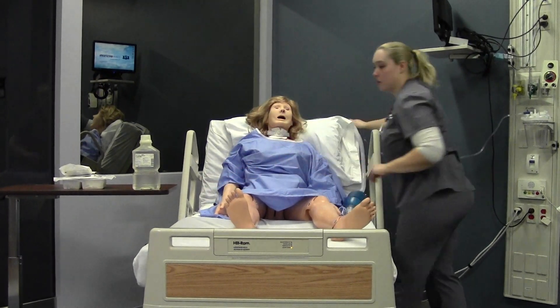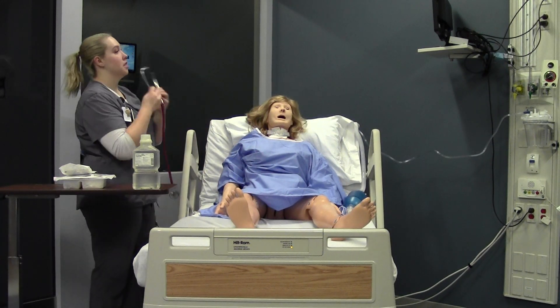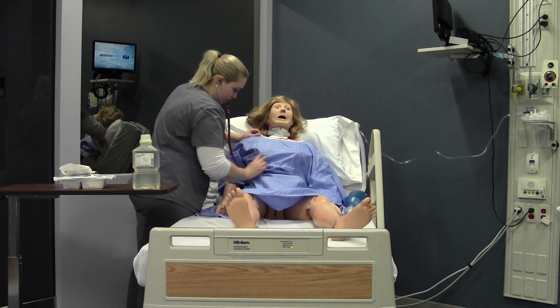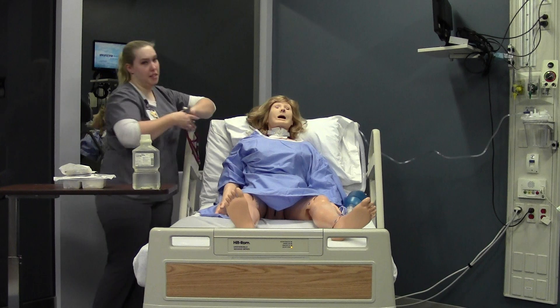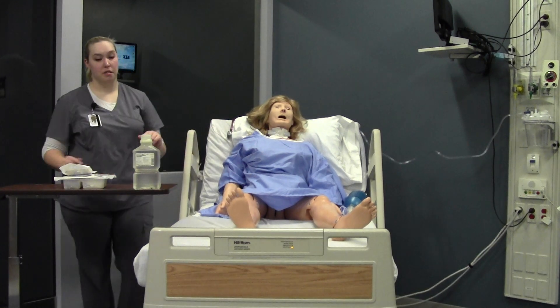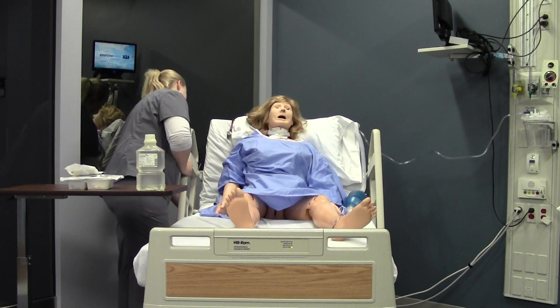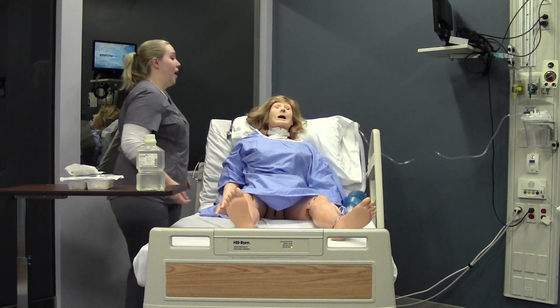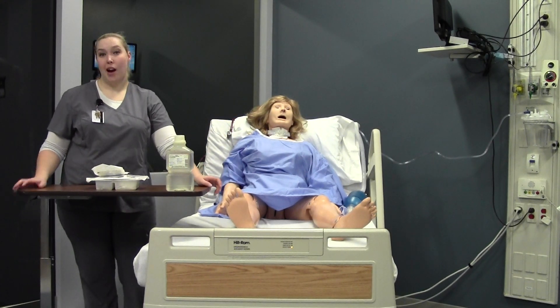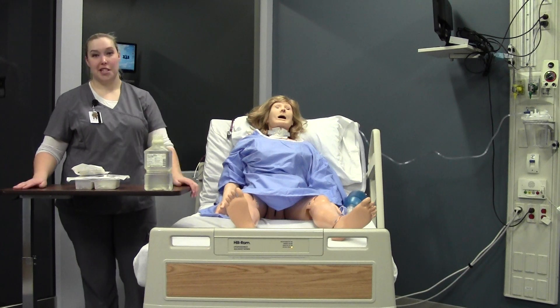Make sure your suction is working. I'm just going to reach around you and get your tubing positioned. You may also want to do a quick respiratory assessment — listen to their front and see how their lungs sound. I don't like to have my stethoscope on me while I perform the skill, so I'll tuck it off to the side. While I do trach suctioning, I have my patient hooked up to the monitor so I can watch their oxygen sats at all times. If they start to drop, it would be a respiratory emergency — we would need to keep bagging them until their sats come up and let the physician know.